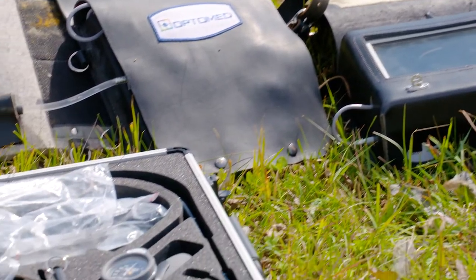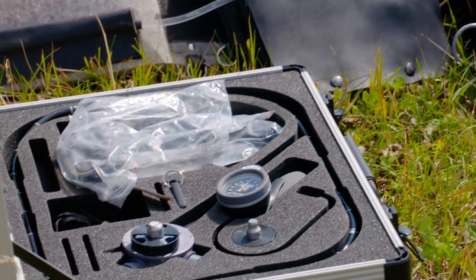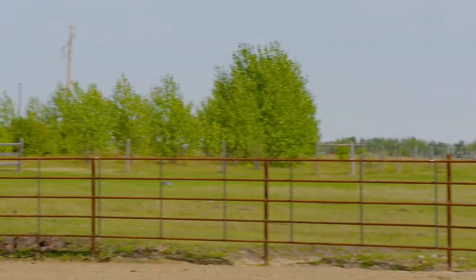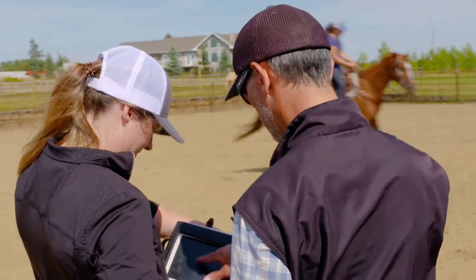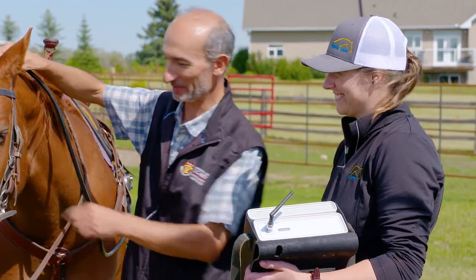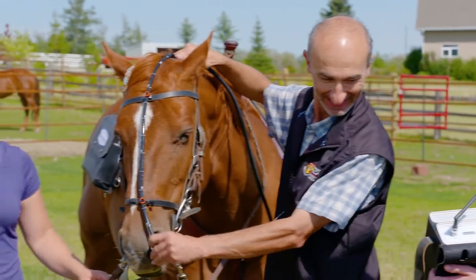Now we have that camera system that is portable and goes on the horse during exercise with the rider riding. So now it provides us all that information we need to look in real time and see exactly what's going on in that throat and then get the best treatment and the best fix for that. So it's called a dynamic endoscopy, and endoscopy means looking inside, so scope for view and look inside. So that's exactly what we do.